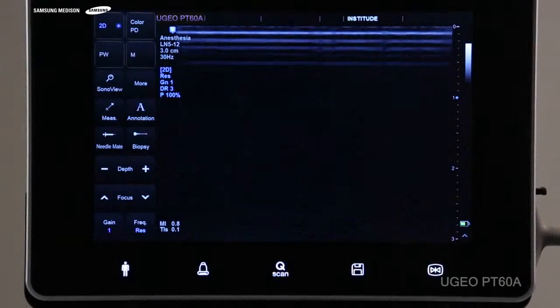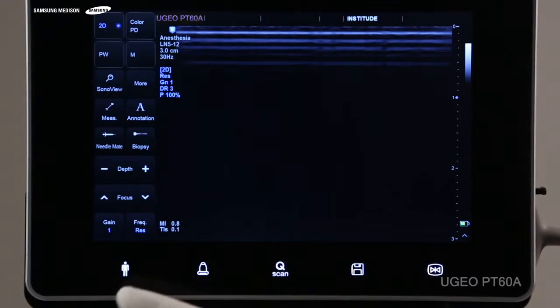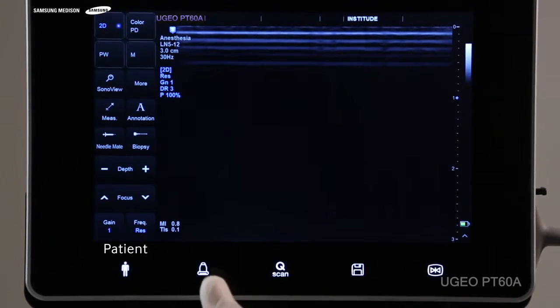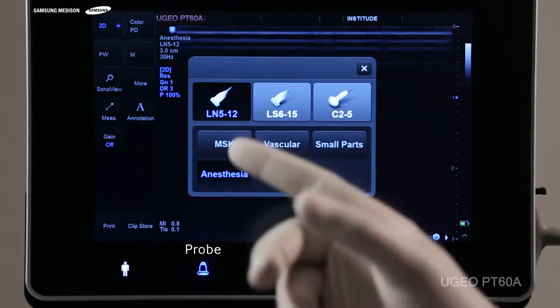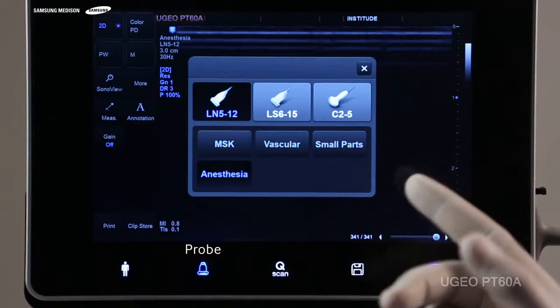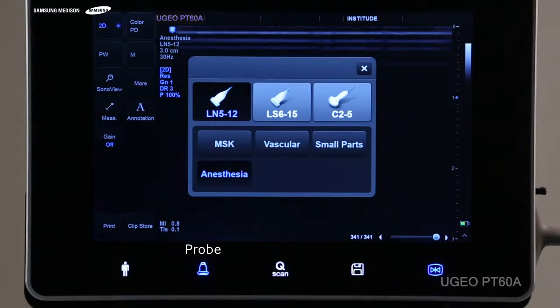I will show you how to use these five shortcut keys on this system. The first key is for entering the patient data. By pressing the second key, you can select your transducer, such as the 5-12 MHz and 6-15 MHz linear transducer or the 2-5 MHz convex.